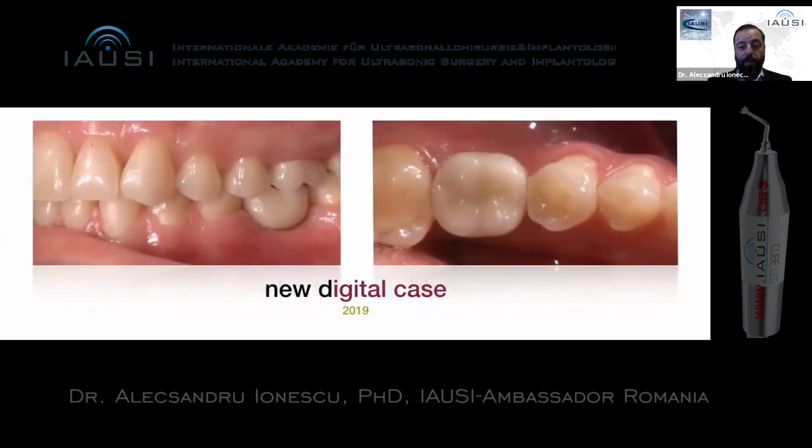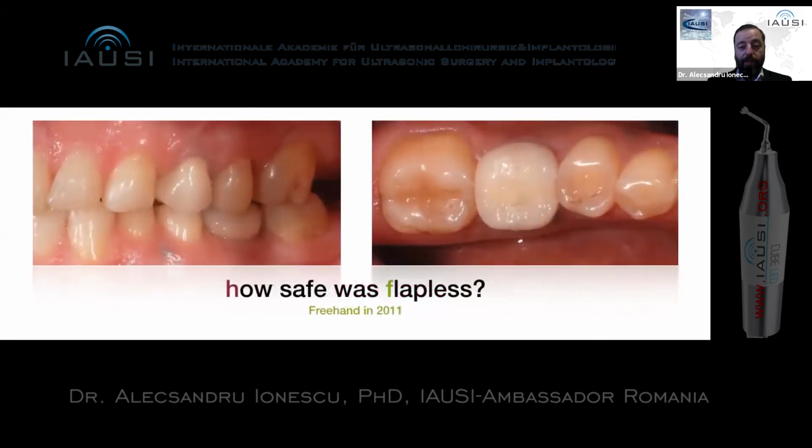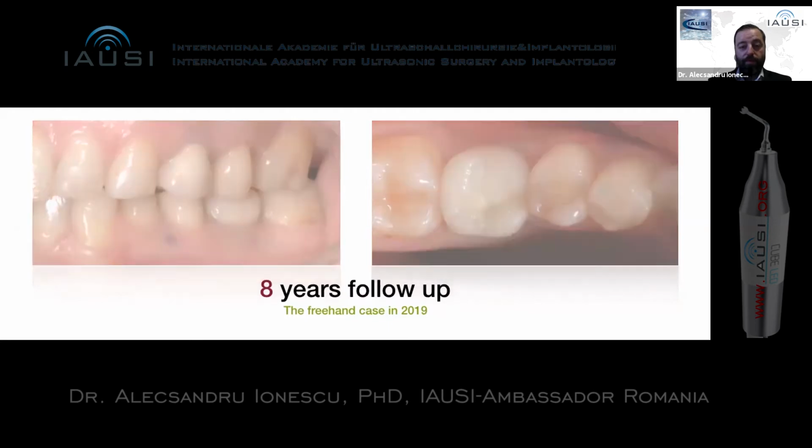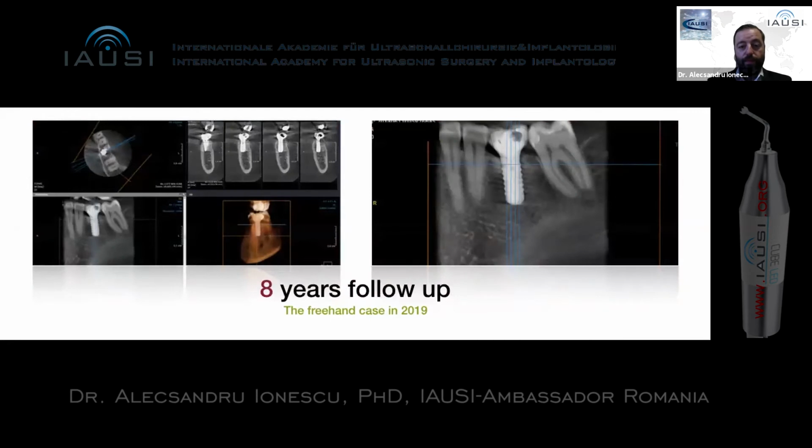And the final case, the digital one, and a follow-up of the old case, how it looked in 2011 and how nice it looks after 8 years in 2019. You can see the papillae and how the crown is there. And again, the CBCT scan and the position of the freehand placed implant in the septum.